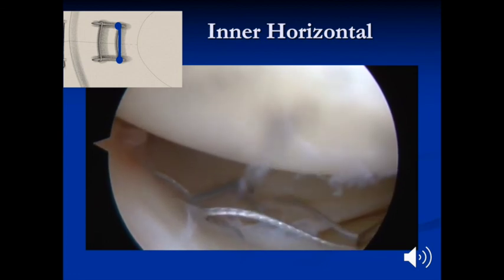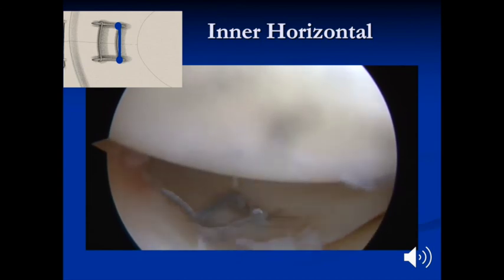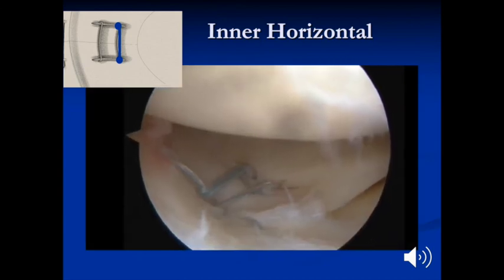The reinforcing sutures, or longitudinal sutures, are tied first, and then the horizontal sutures are tied over top of the capsule.